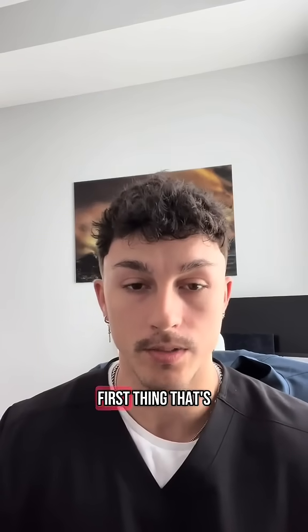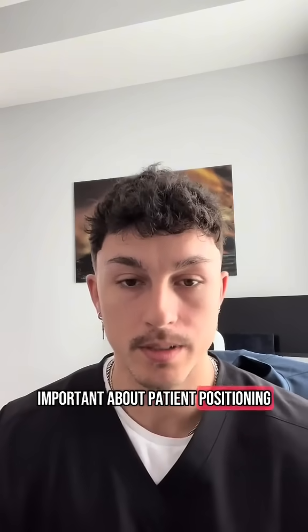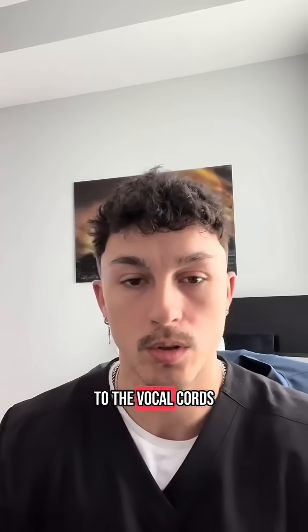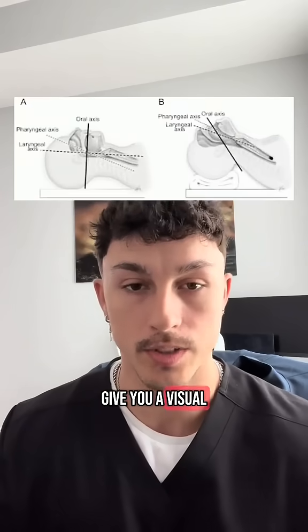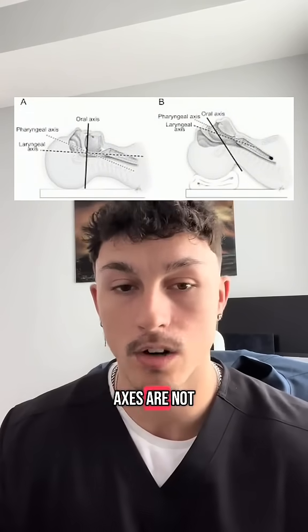So obviously the first thing that's really important is patient positioning. What is important about patient positioning is that there are 3 axes that we want to align, like I said, in order to give us that best direct shot to the vocal cords. And that is your oral axis, your laryngeal axis, and your pharyngeal axis. So here's a picture to give you a visual. When you're just laying down flat, you can see how these axes are not in alignment.